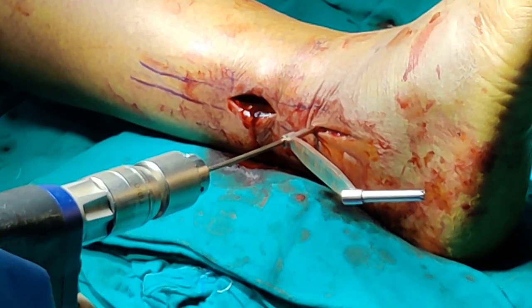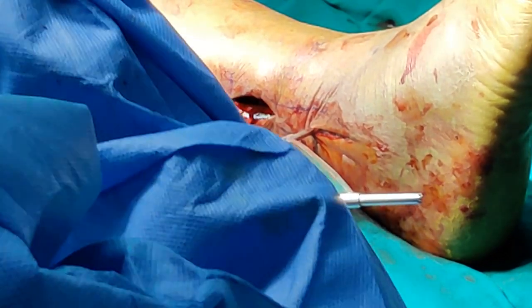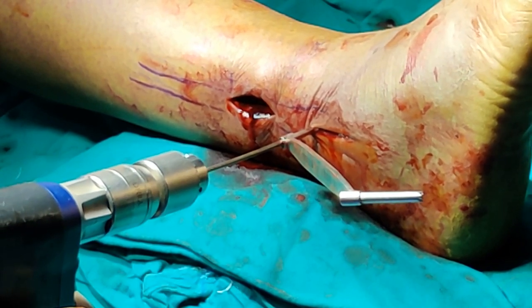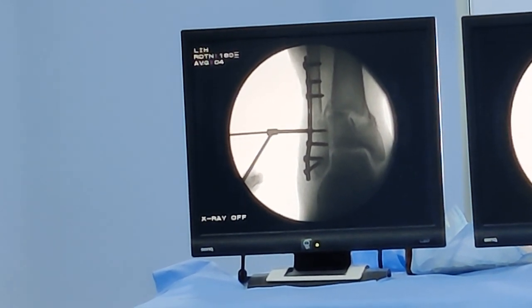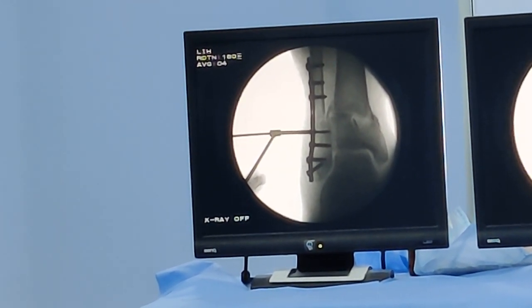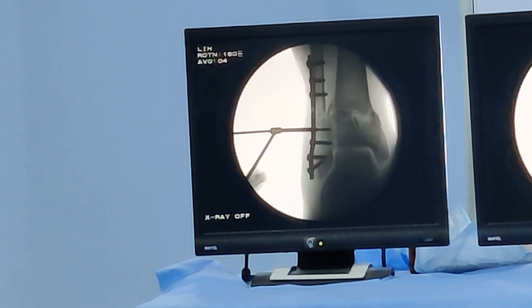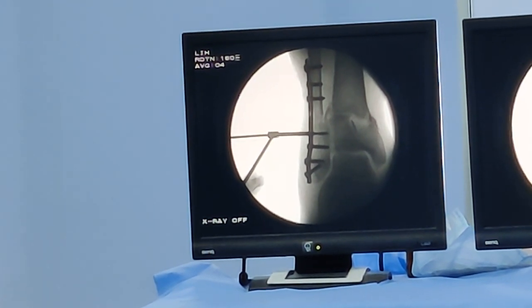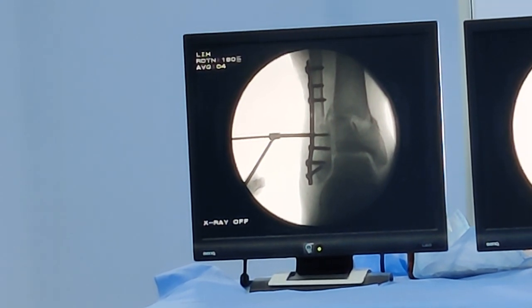Through the same incision I am checking the position of the sleeve on the C-arm — the drill position looks good. You do not want to penetrate into the inferior tibiofibular joint, so be careful not to go into the joint. My only job now is to replace it with a suitable size screw and that will be the end of the operation. Plate fixation is done and it is just a matter of routine closure.